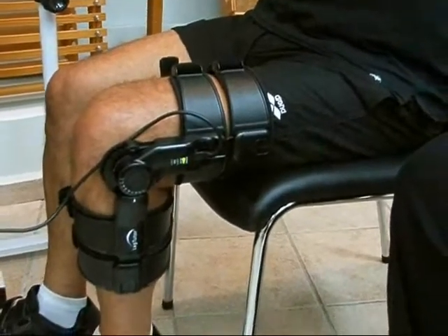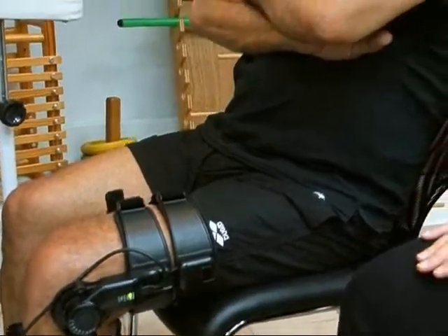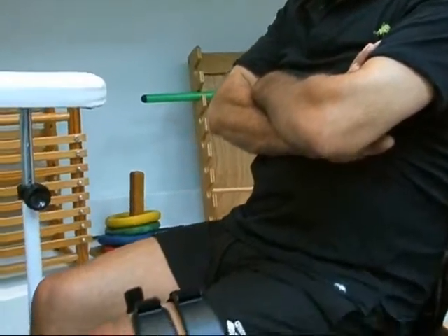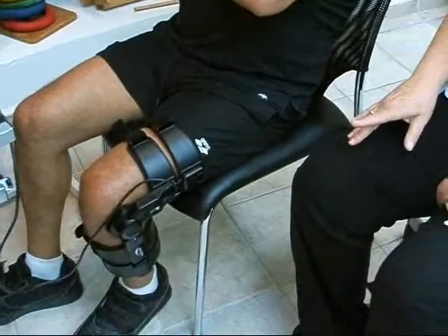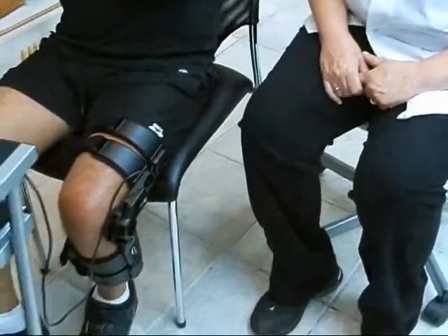The system allows the patient to practice repetitive active exercises in the form of motivating and challenging games. The games are customized to the patient's motor, sensory, and cognitive movement ability, and the patient has the possibility to start exercising even with very limited active range of motion.